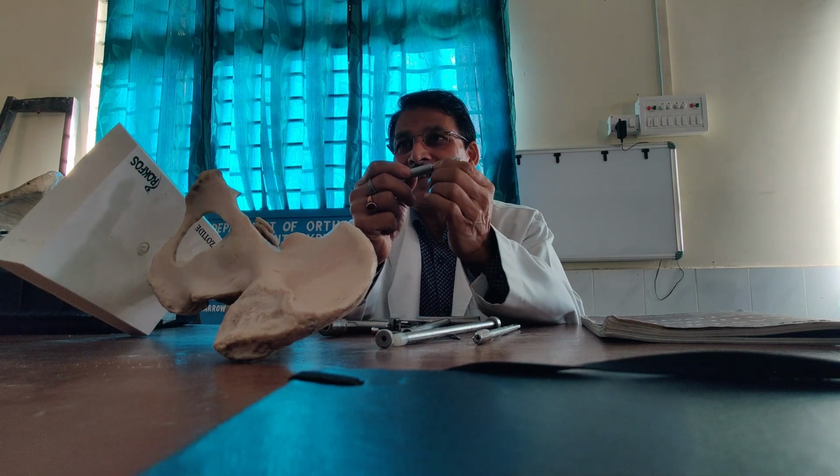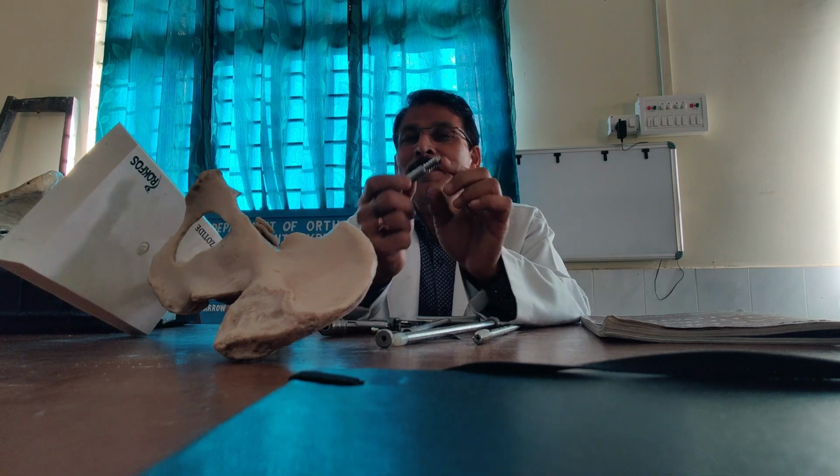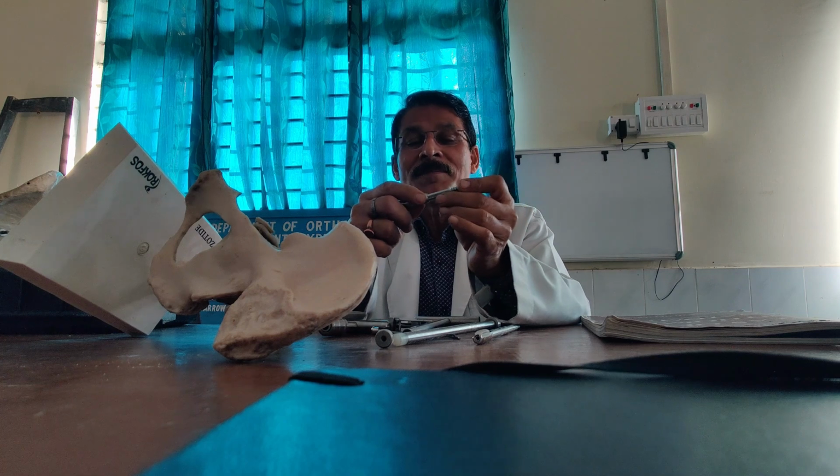But compression is what? One device is this, another device is this. There is compression and deflection here. Yes, compression. So if it is stuck here, then how is it going to help you? No, it will cut through. So that means a part of this should be made free, so as to have a good excursion.